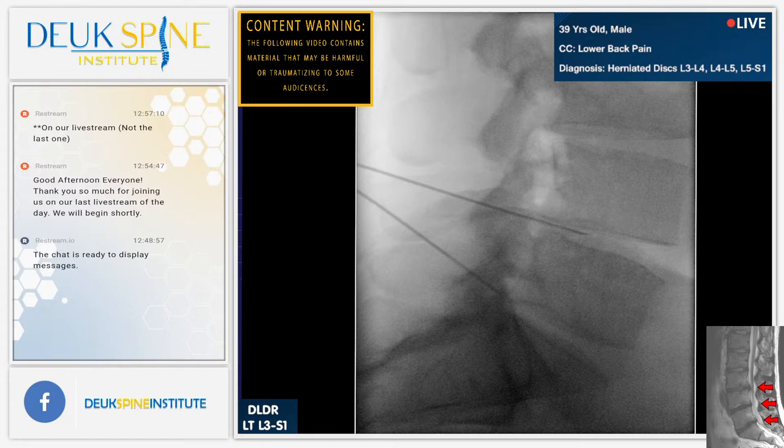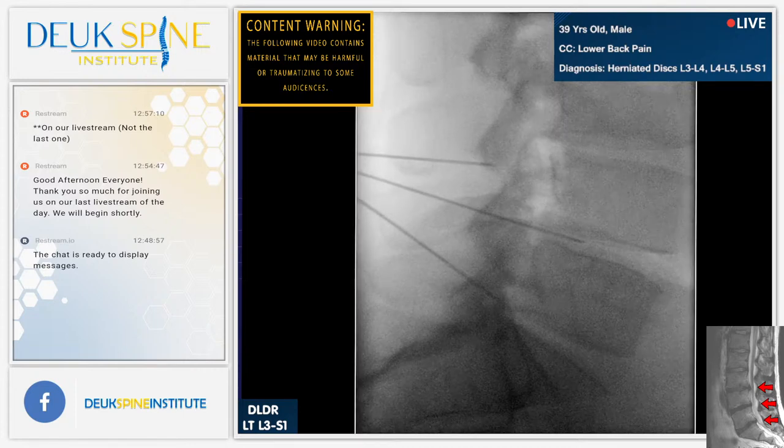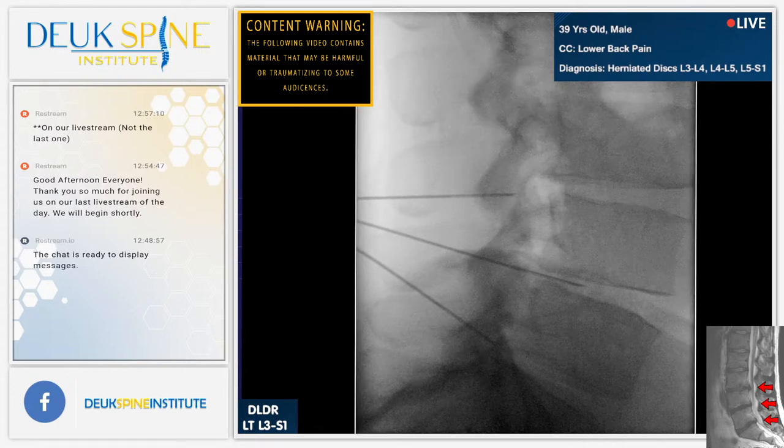And this is going to be the L3-4. That's almost perfect. You need to move a little north. You're off on your wag. I would just wag it. Leave the base where it is. That's better. That's better. Shot. Shot.